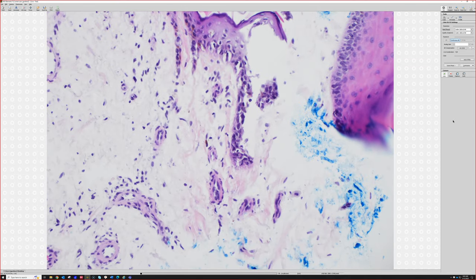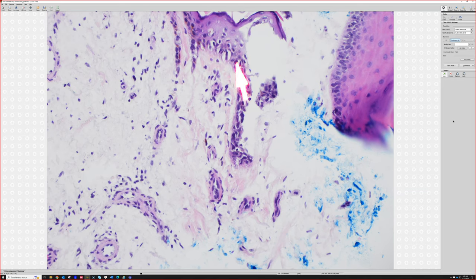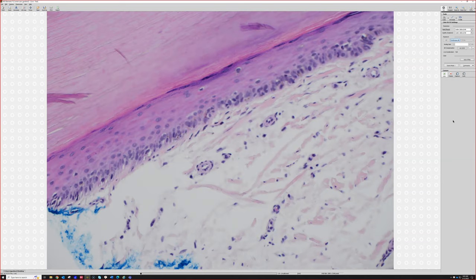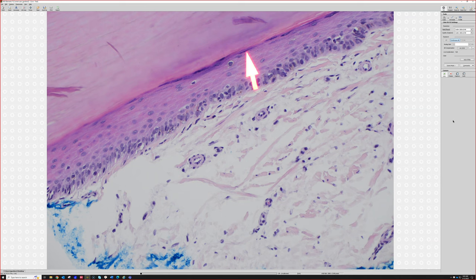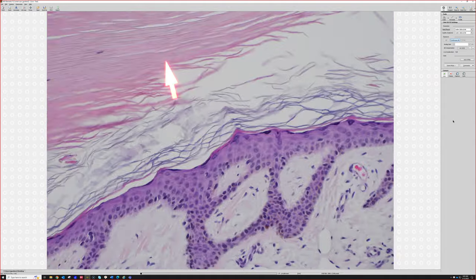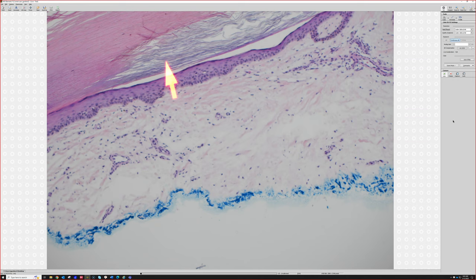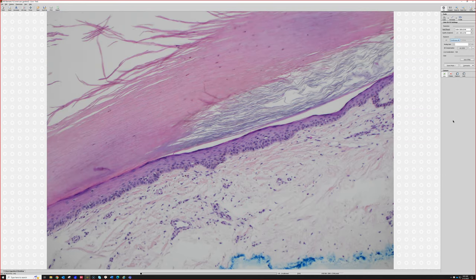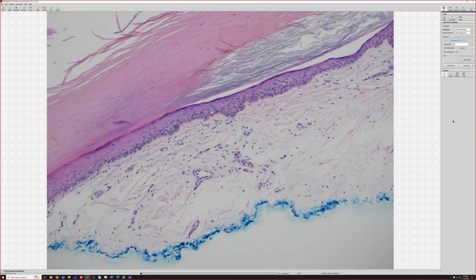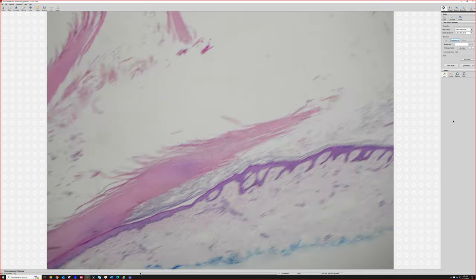And then here, it's a little hard again in this case to show, but if we did a SOX or a MART, all these cells would be melanocytes. And there are more of them scattered along the basal layer here with occasional pagetoid spread. And they're not super ugly, but they're not normal looking either. They're enlarged. And I think that nail and melanocytic lesions are very challenging to evaluate. I really struggle with these. And I have often sent these to experts to look at because I find them hard.